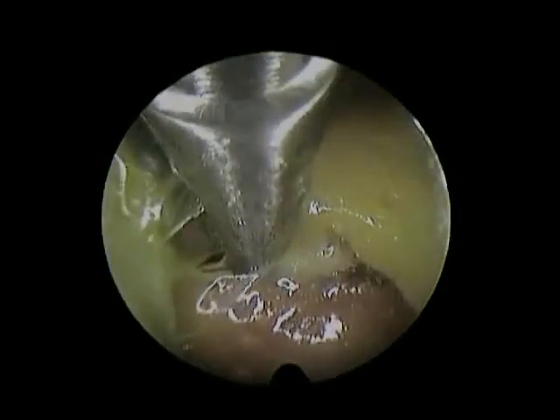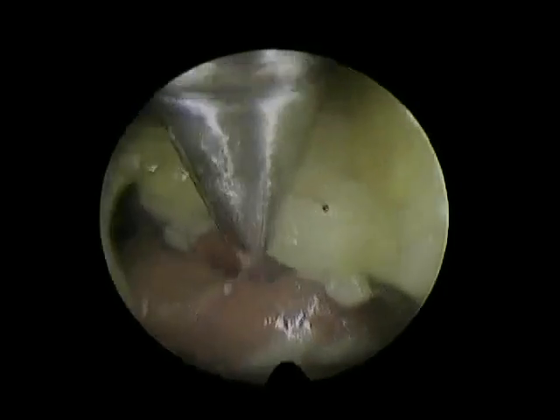Here I'm trying to get in through the peritoneum. Well, I think that's the peritoneum. Maybe that's not. So with the scissors, I cut through and see that little hole. I did that. So that gives you really satisfaction to see that you're able to do things with the surgical instruments. Just exercise and just training. That's the point of the whole idea. You see? There, again. And the more I train, the better I feel about myself.